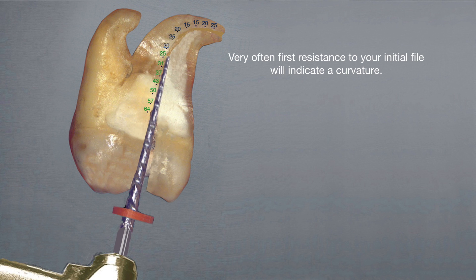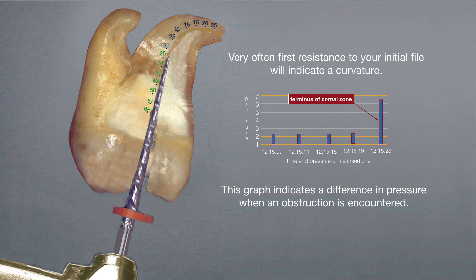As we've clearly seen from our research, this graph indicates a difference in pressure when an obstruction is encountered by a file in a canal.